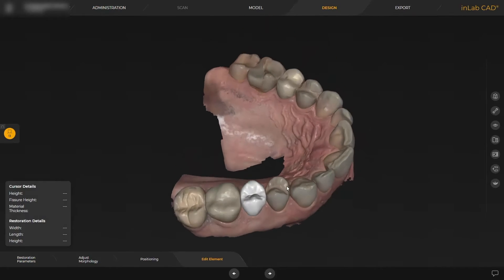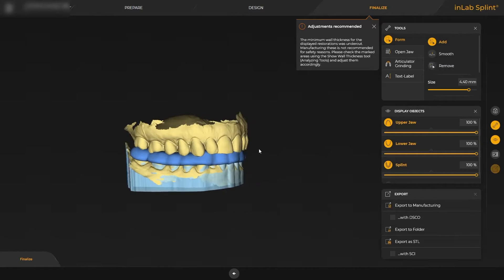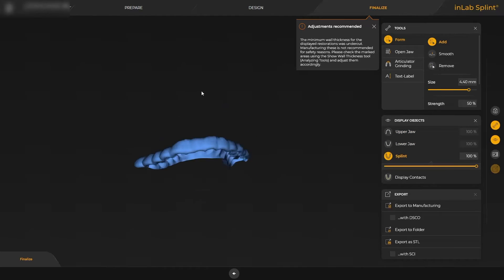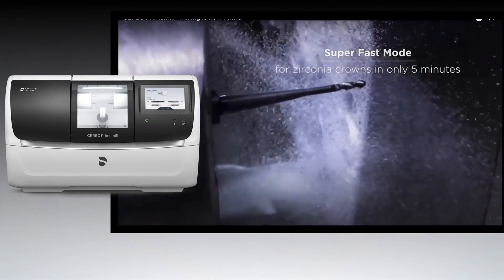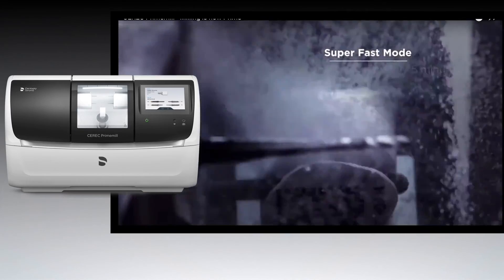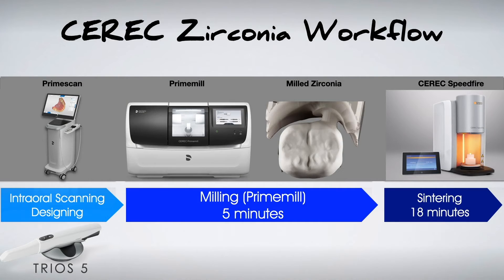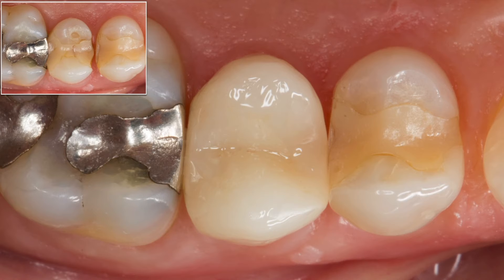We're going to design a crown to be milled with the CEREC prime mill. In this particular case, we also designed a lower splint, which is going to be set to print via the prime print. The new integration with 3Shape and DSCore allows all TRIOS scans to have seamless integration into the fastest chair-side milling unit on the market. Milling for a zirconia restoration takes roughly five minutes, usually less, and you can sinter it in the CEREC speedfire in about 18 minutes. Here's that zirconia crown on the bicuspid produced with the prime mill and sintered with the CEREC speedfire.